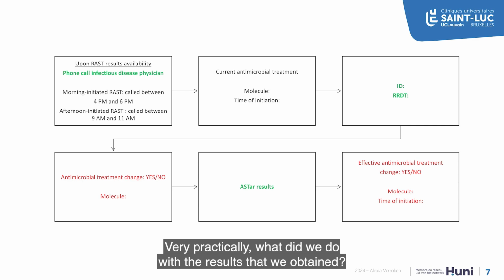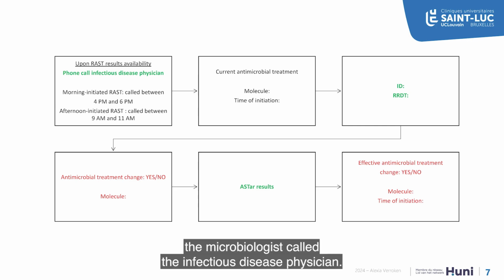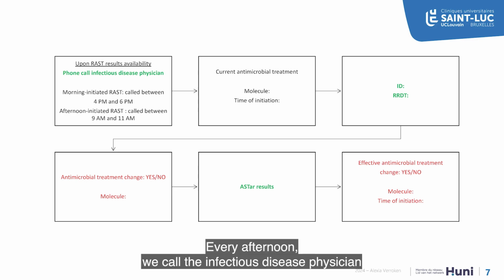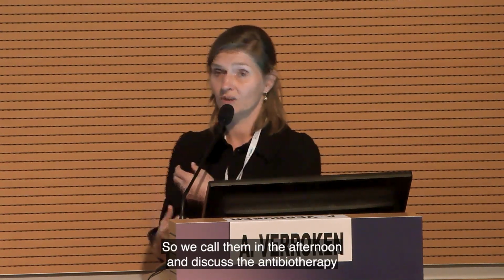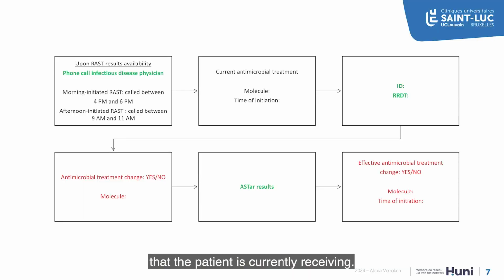Very practically, what did we do with the results that we obtained? So once the RAST result was available, the microbiologist called the infectious disease physician. This is something we always do. Every afternoon, we call the infectious disease physician to communicate the new results of the positive blood cultures, and we discuss the antibiotherapy that the patient is currently receiving.